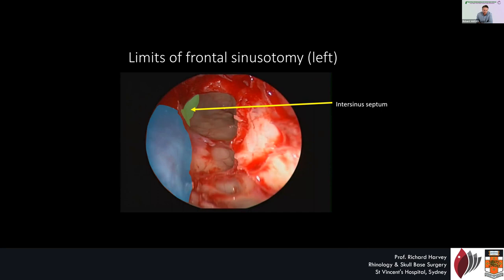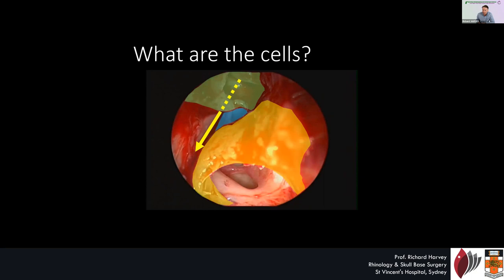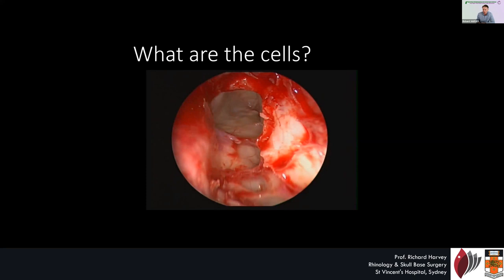This is what's important. I discourage my trainees initially from trying to understand exactly where the drainage pathway is. I ask them to go and find the boundaries of the frontal recess, because for many of us, trying to find the clefts and spaces is not possible when there is pathology and prior surgery. It's the fixed landmarks, the fixed anatomy that we're looking for. You can say this is an agger nasi, supra bulla and bulla, and that may be somewhere in between where the frontal sinus drains. But this is not how we should be teaching anatomy, especially for people starting out. We should really teach them how to find these boundaries first — following the orbit up, following the middle turbinate up.